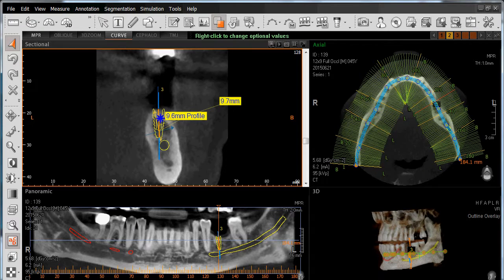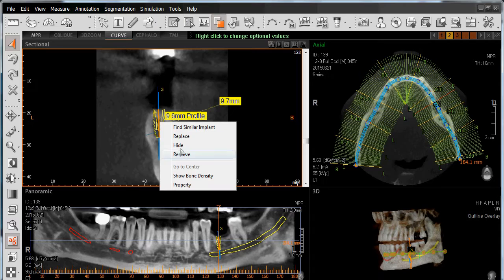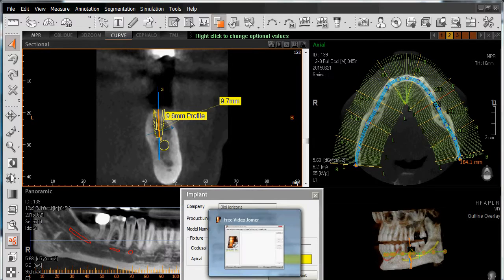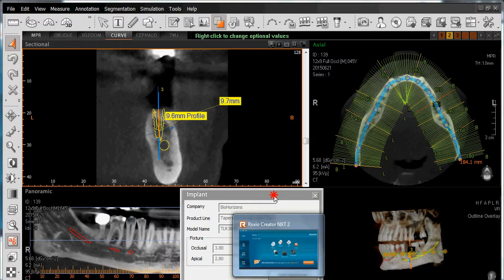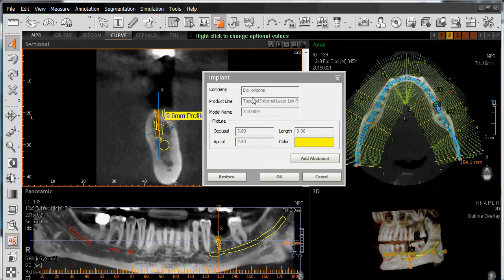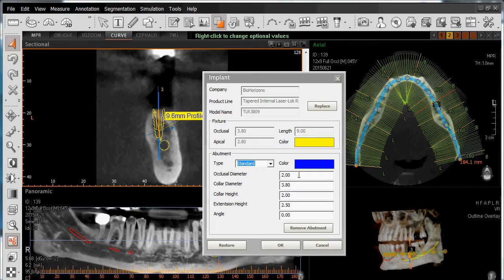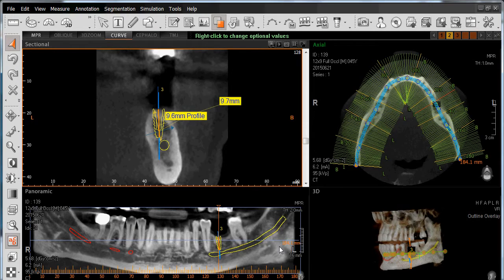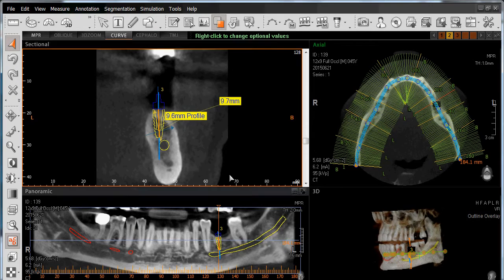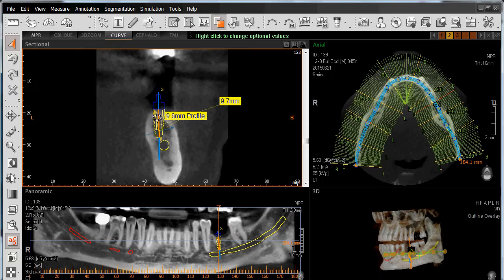The last right-click feature is going down to Property to verify our implant system and then add our abutment. Left-click on Abutment, choose our type, specify our size, and then left-click on OK. We've now placed our implant as well as our abutment.